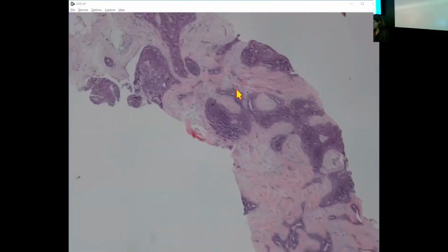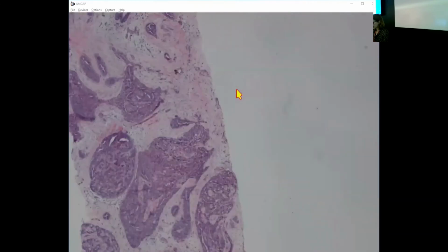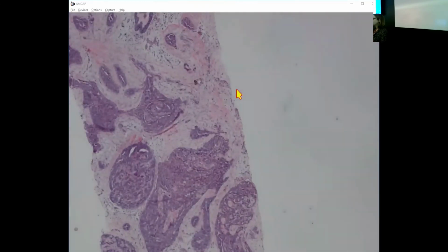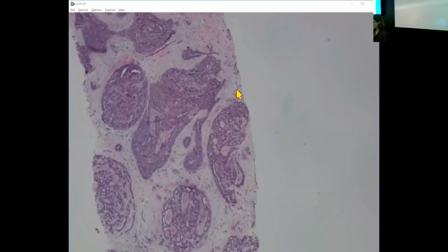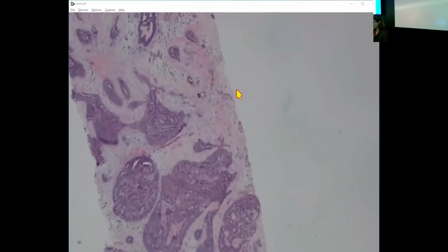here's another one of these tricky things where you've got a lot going on, right? This is, say, a 48-year-old woman with a 9 mm nodule. There's a lot of proliferation, a lot of stromal change, and irregular contours to some of the nests.